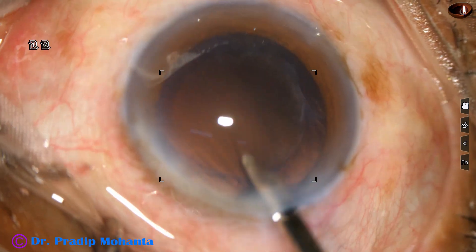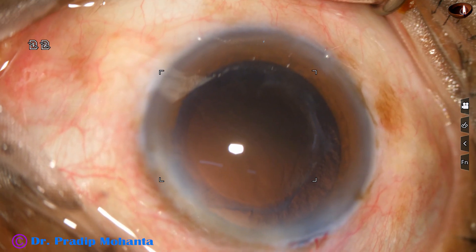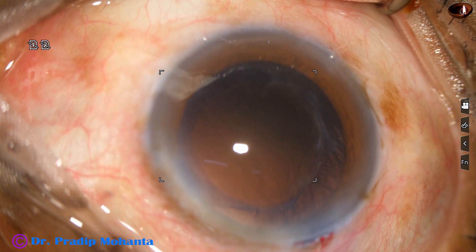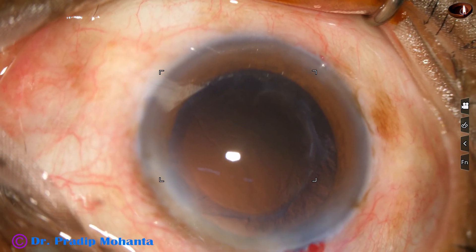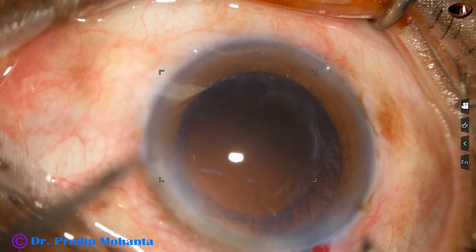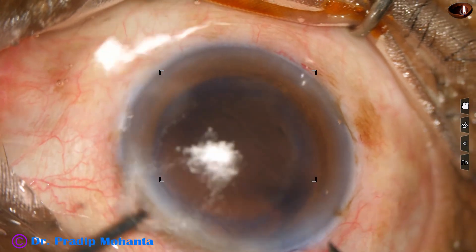Cortical clean-up has been done. It is very satisfactory. There is some fibrosis in the posterior capsule from 6 o'clock to 9 o'clock, but this is in the peripheral part of the posterior capsule and it will not cause any hindrance to vision.